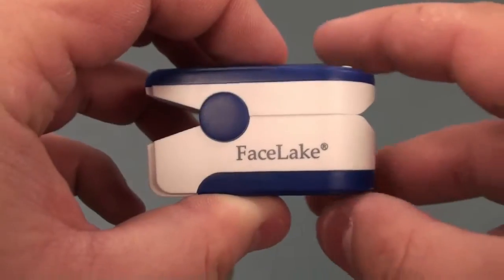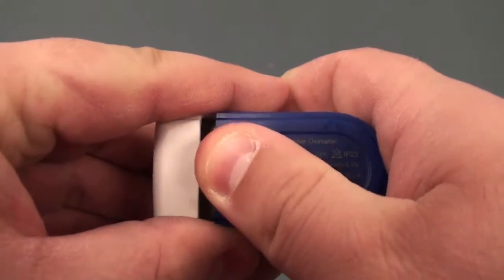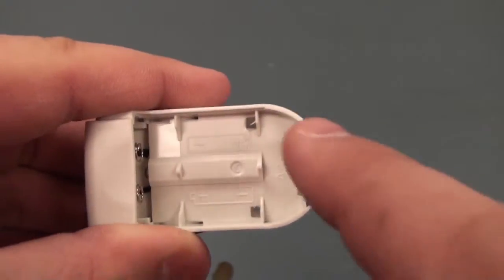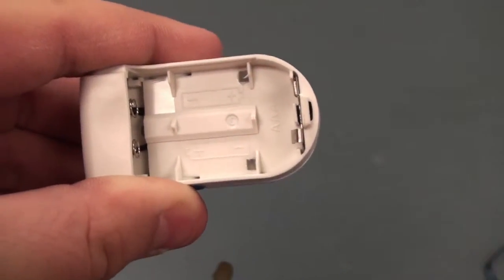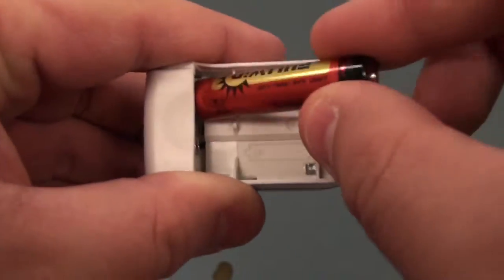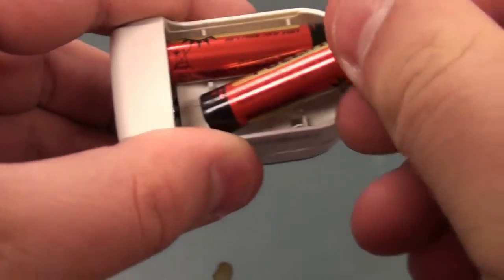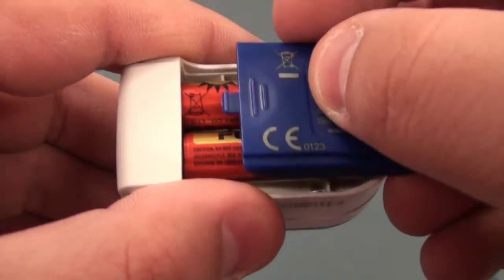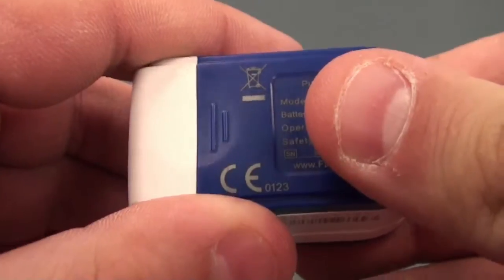To install the batteries, flip the device over and carefully slide the backing off. Inside the device, you'll see a plus minus picture showing the directions of the batteries. Install the batteries as the device asks, and place the battery cover back on and slide into place.